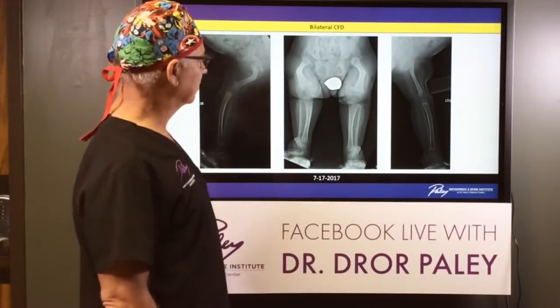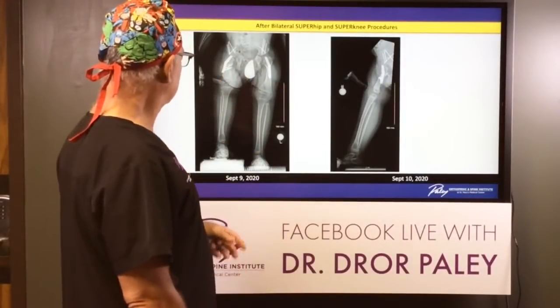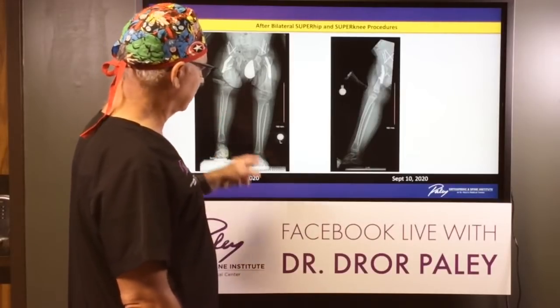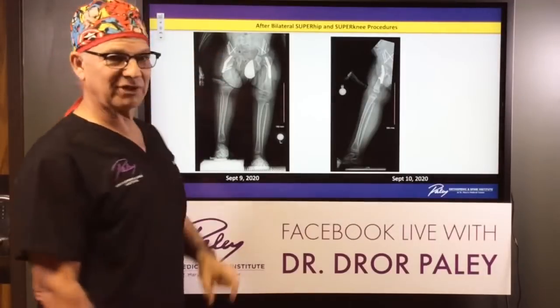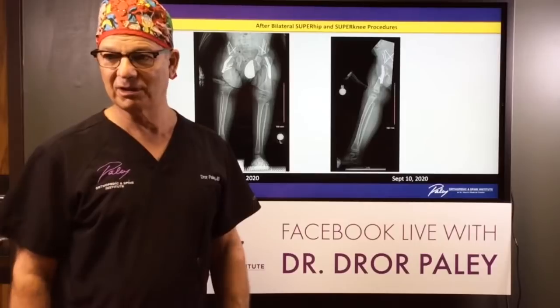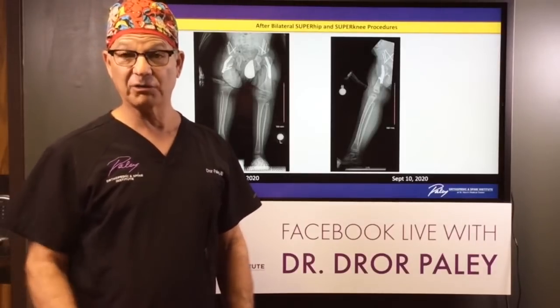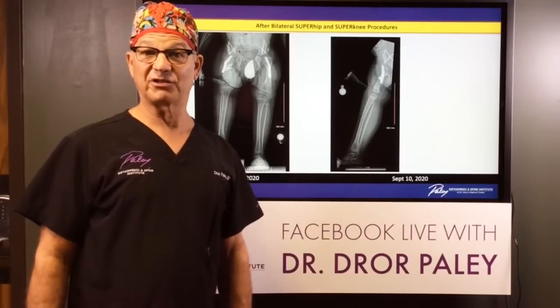This is incredible. And in the thigh, you've got a lot more soft tissue. They get more infections, more issues, more pain. This kid has no pain. Therapy has been so easy because of the lack of pins and everything else. And he's quite young, and he's got a really tiny femur. So this is the shortest bone that we've lengthened with the precise plate. Really exciting.